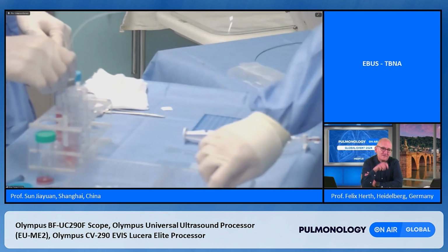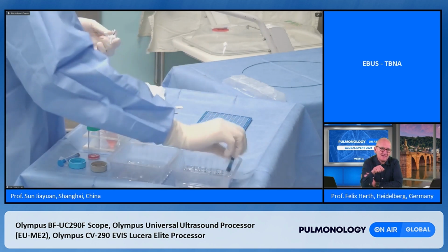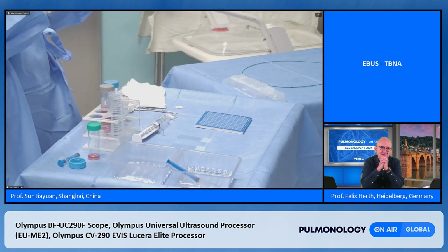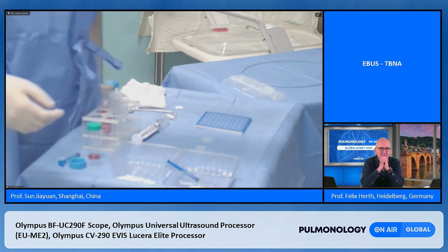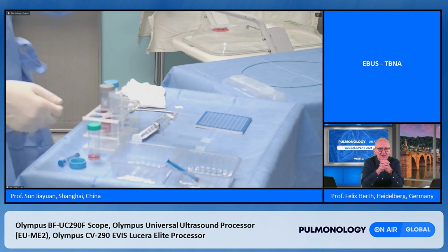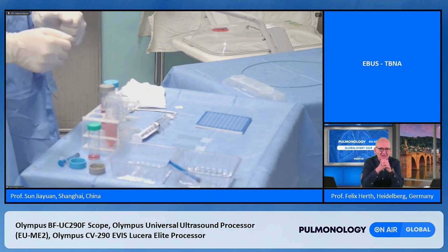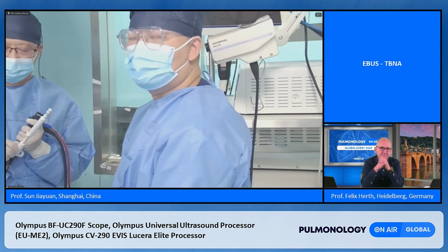And what you nicely have seen at the 7 lymph node position, Professor Sun inserted the needle and then used that dedicated stylet from Broncus to create a tunnel, and through that he took the forceps biopsy. Based on the forceps biopsy you can do all needed molecular testing because you have more material. For sure you can also do that on cytology material, but we have the impression that you get more signals on larger specimens.